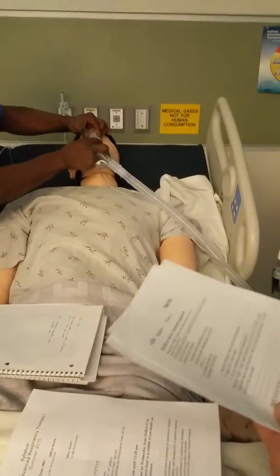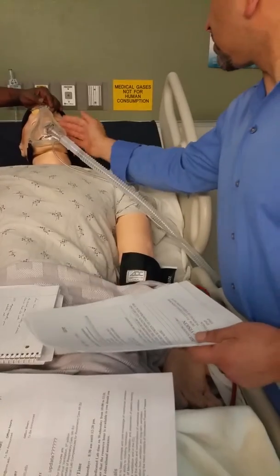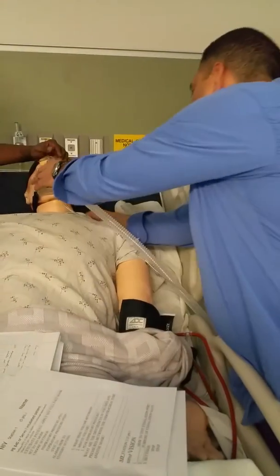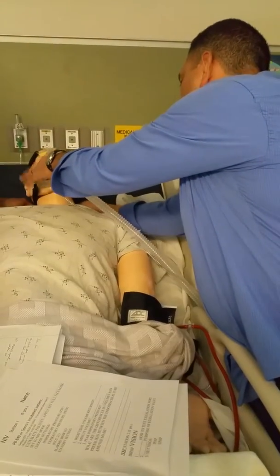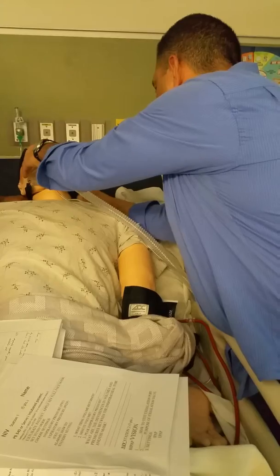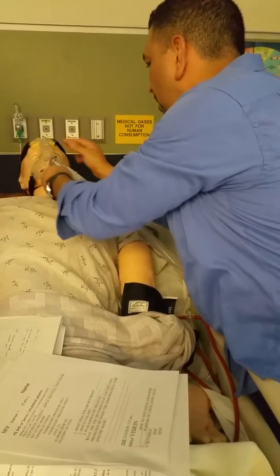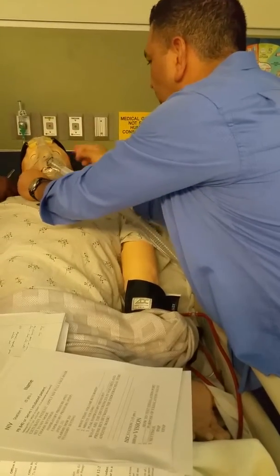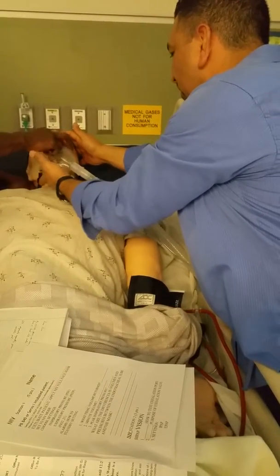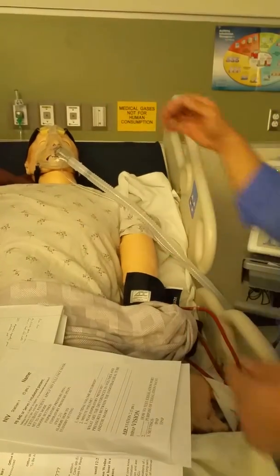It just could be our flow, the way he's just not getting it nice and still somehow. I don't know if he is going to get a decent seal with this one.